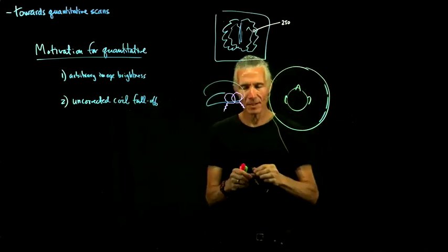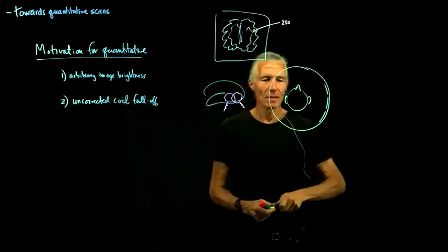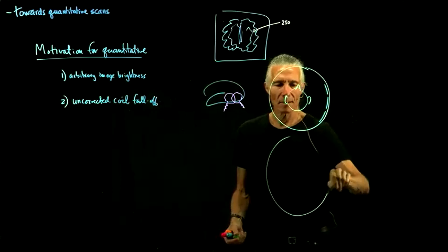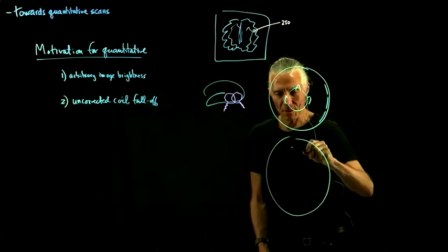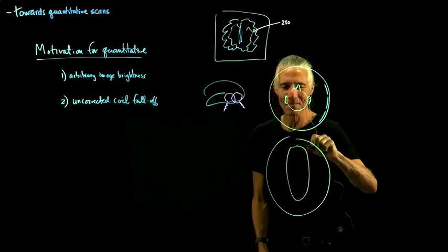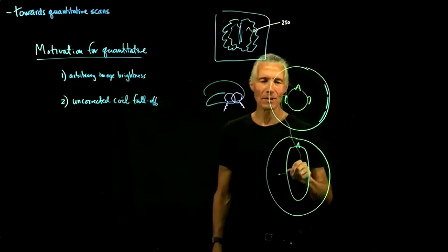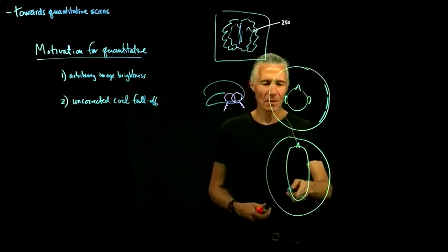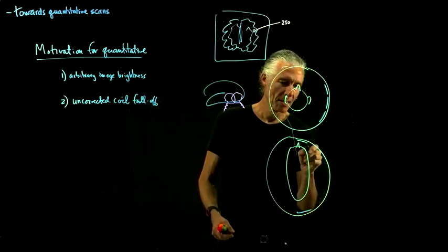Compare that to a situation where somebody, like me, has a very long head. When I go in the magnet, I'm quite long, and I kind of run into the top of the coil, and the back of my head can be pretty close to the coil.